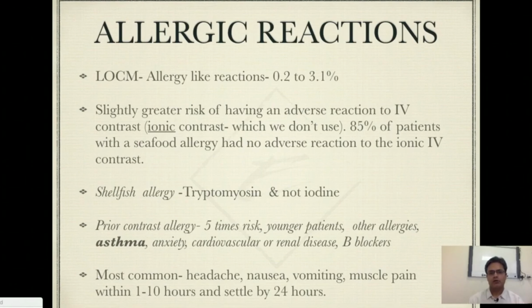These are patients who've got history of asthma, who've got prior contrast allergies, or young, anxious, who may have renal disease or cardiac disease. All these things make people more likely to have contrast allergies, and these are the people where you've got to be extra careful. But fortunately, most of the reactions we get are kind of mild and normally settle down within, say, the first 24 hours.